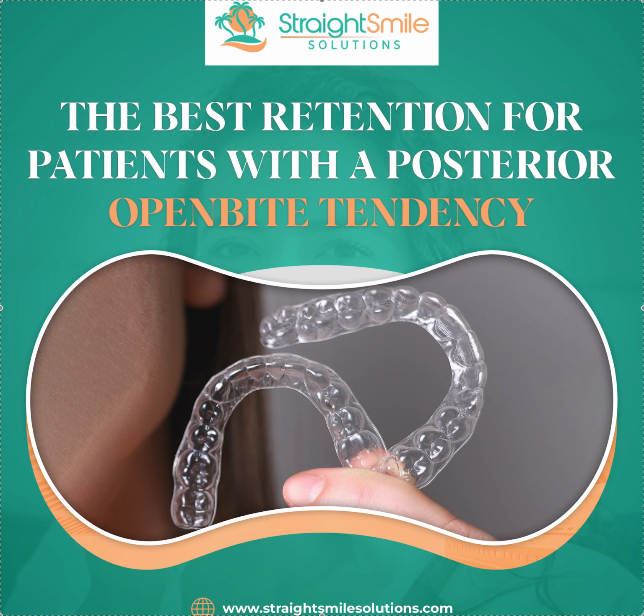For the most part, I try not to have my patients wear their retainers full time for more than 3 months. Why? Because this is what can happen, especially if they were a patient that was having a problem with posterior open bites during treatment. That should be a red flag to you. If you're chronically dealing with posterior open bites during treatment in a patient, then this probably is not a patient you want to do 2 Essix retainers in. You can do 1 Essix over a Hawley, you can do 1 Essix over a bonded, but probably not 2 Essix retainers. Why? Because you're going to have a posterior open bite.